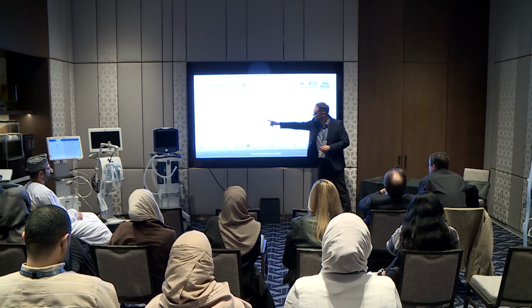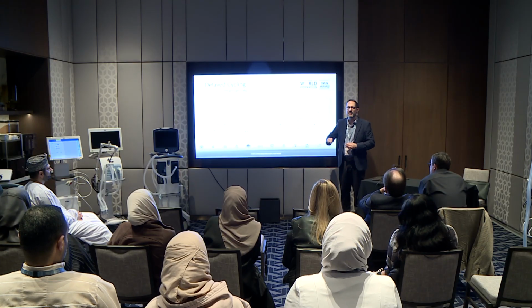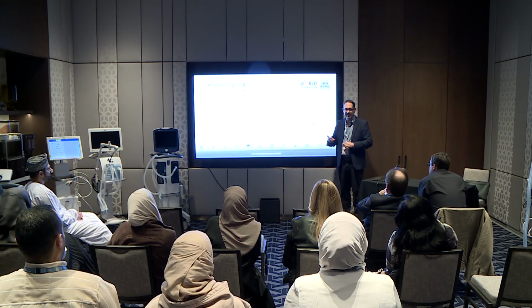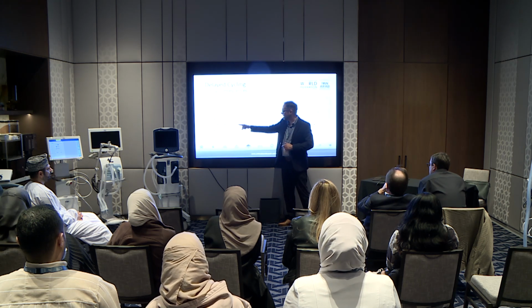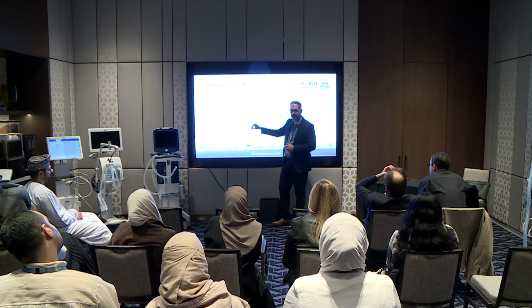So that's if it's a cycling problem, but delayed cycling can also be caused by giving too much pressure support. If your tidal volume is excessive, it takes longer to reach this peak down to here. So maybe if you lower your pressure support, you'll actually end up like this. But if you increase pressure support, it takes longer to get down here.